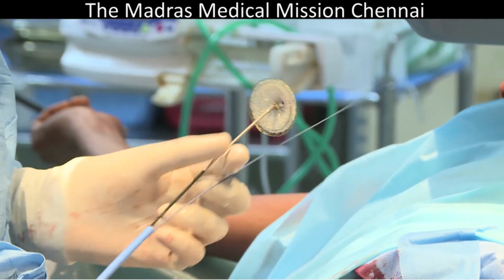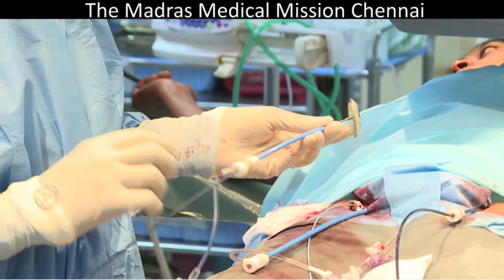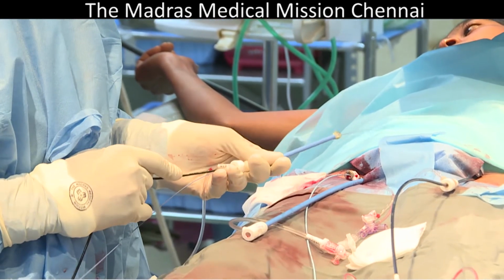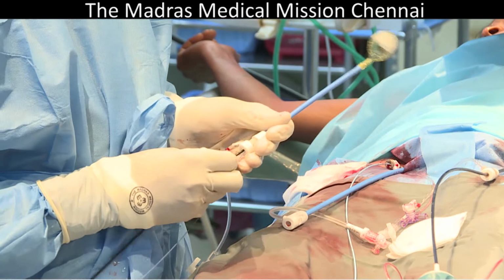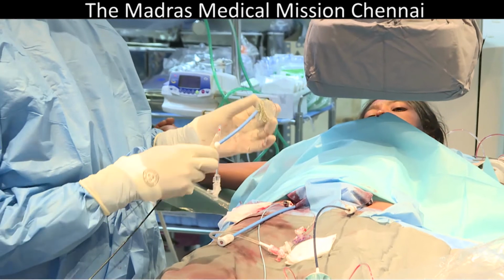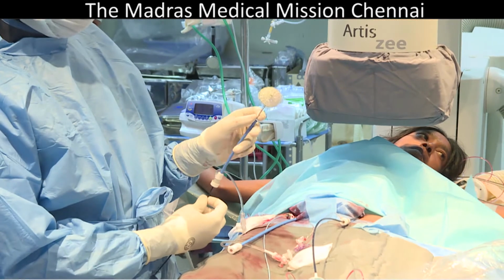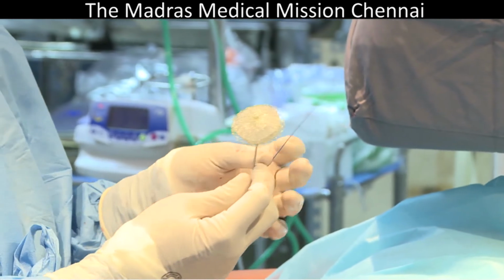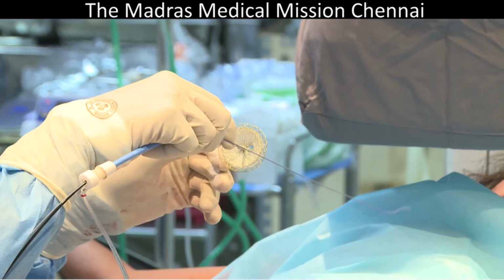But let me tell you one thing. I will now sheath it inside and then show you after. What size fenestration is this? 6 millimeter. So now I am getting it opened again. Now you see that sometimes the fenestration doesn't fall in place properly. And Shiva, the patient is watching too. Yeah, she's watching. So she's being mindful of that. She's very interested in the fenestration.